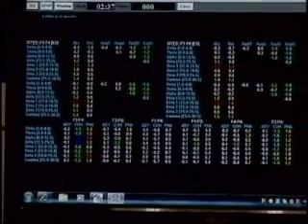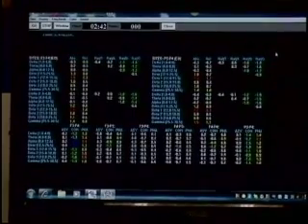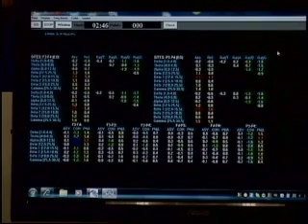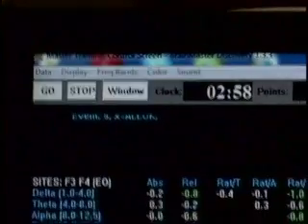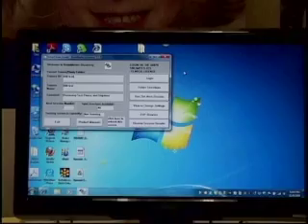Now let's walk through bringing in Z-score based settings files from our standard BrainMaster software, putting them into the Discovery, and then seeing what it looks like when we're actually getting feedback in the Discovery for Z-scores. So I'm going to stop this session by hitting the stop button. It asks, are you sure you want to stop running? I say yes. Save the EDF to disk? Not this time, but if we wanted to, we could. So I hit cancel and close the training screen.